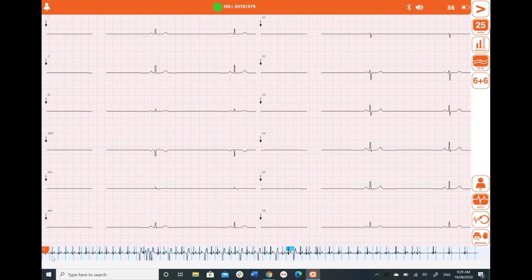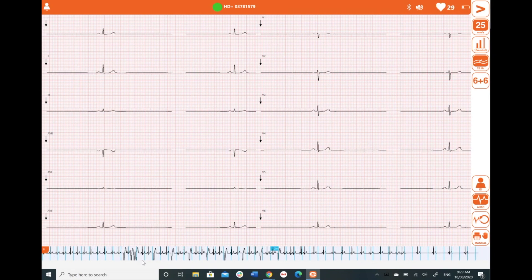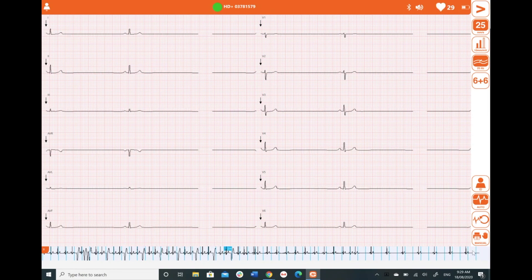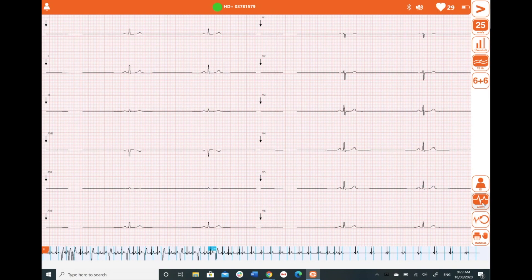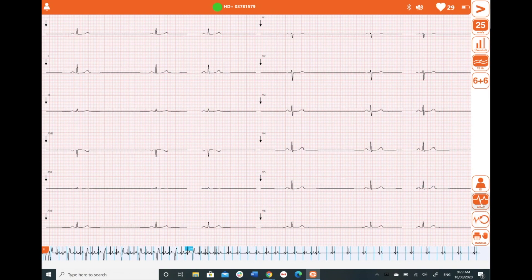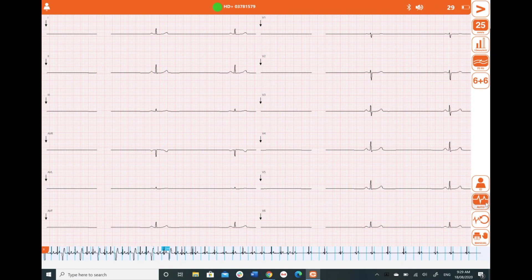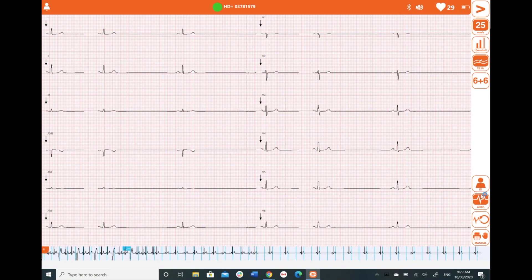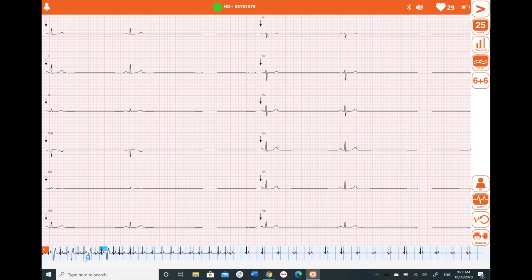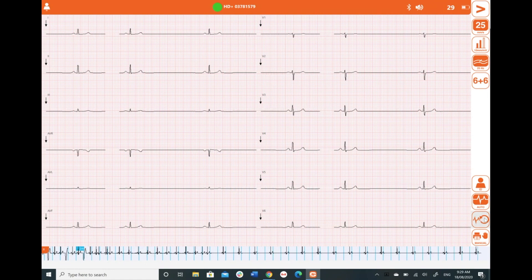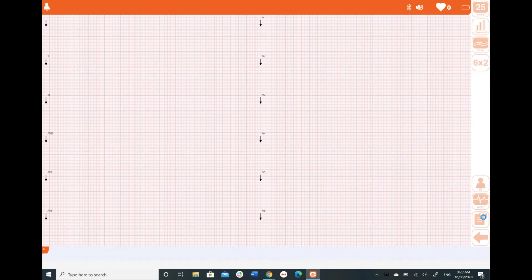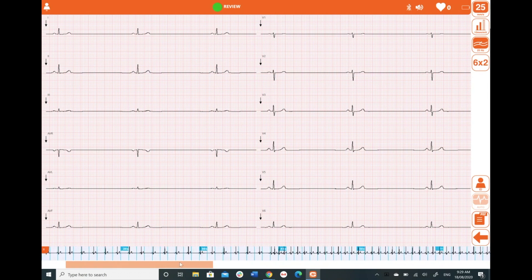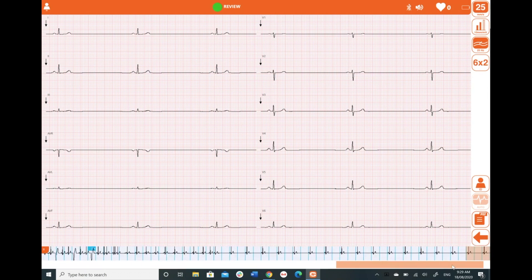We can see normal sinus rhythm, some arrhythmias we want to look at, and a slow heart rate we want to capture. Rather than hitting the auto button — which only gives you what's on screen, the last 10 seconds — we want to hit the review button if we want more than one, or the ability to scroll through. I'm going to click that review button now, and we'll notice the scroll bar down the bottom that lets us go back and view the whole strip.